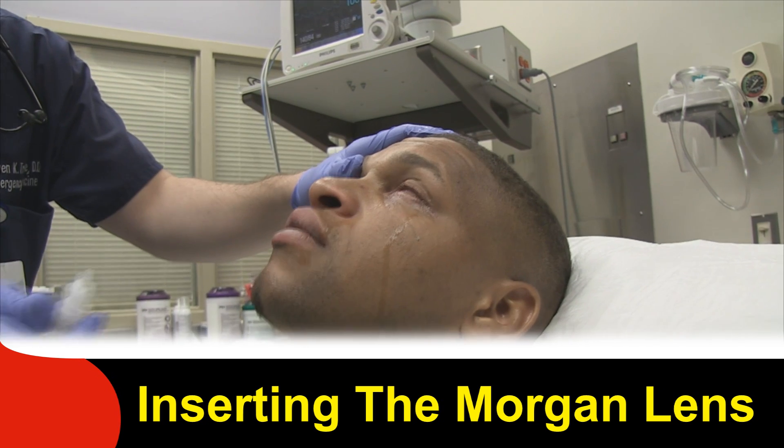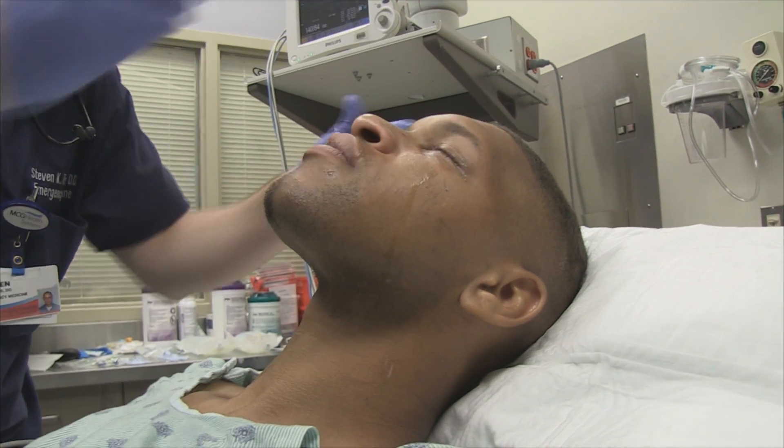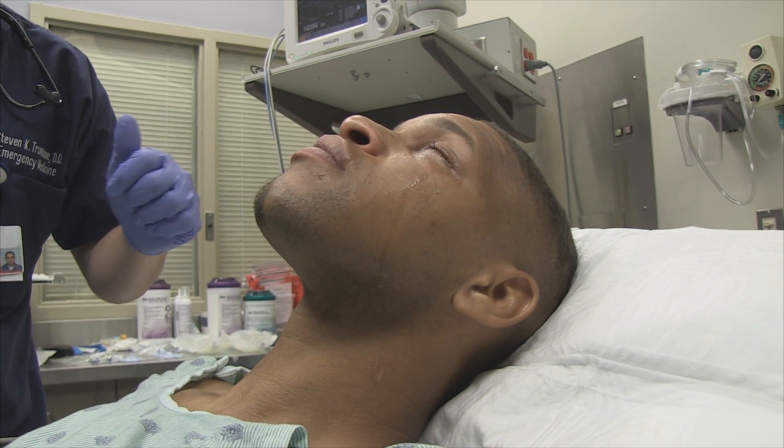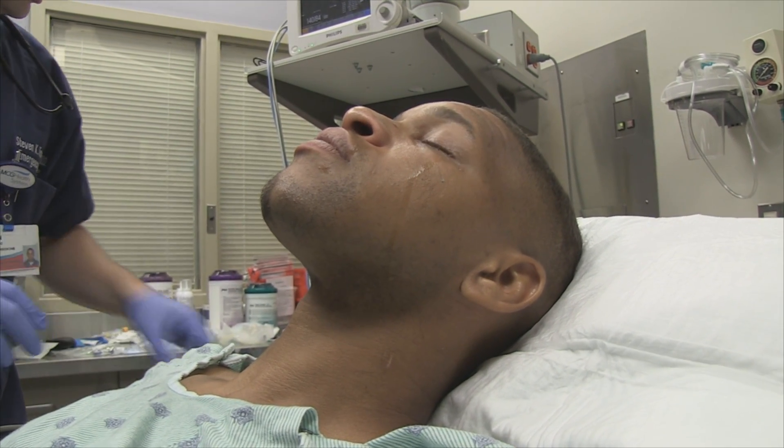Steve, tell us each step of the way what you're doing. First, we're just numbing with the tetracaine drops to give him some pain control and help him tolerate the solution.